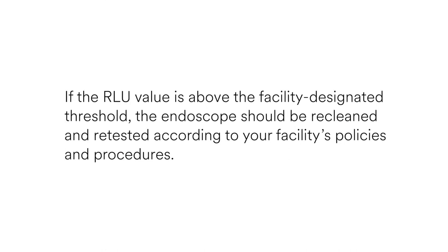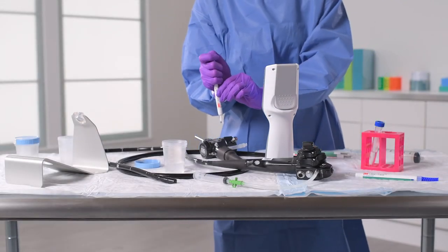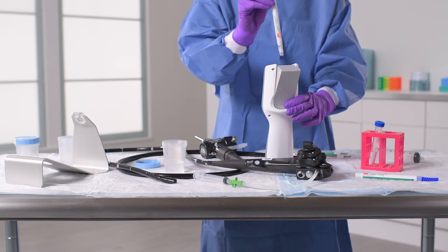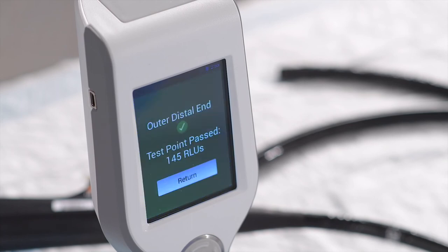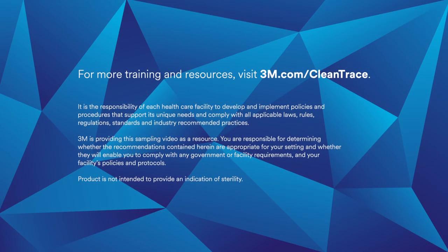If the RLU value is above the facility-designated threshold, the endoscope should be recleaned and retested according to your facility's policies and procedures. Follow the same click-and-shake steps to activate the remaining ATP tests and the same steps to measure your results using the luminometer. Alternatively, you can activate and measure each ATP test after collecting each sample instead of waiting to activate and measure all tests at the same time. Your selections on the luminometer screen will vary by test, so follow the on-screen prompts. Always refer to the product manuals or the product's instructions for use. For a system overview and detailed walkthroughs of additional sample collection procedures, visit 3M.com/cleantrace.